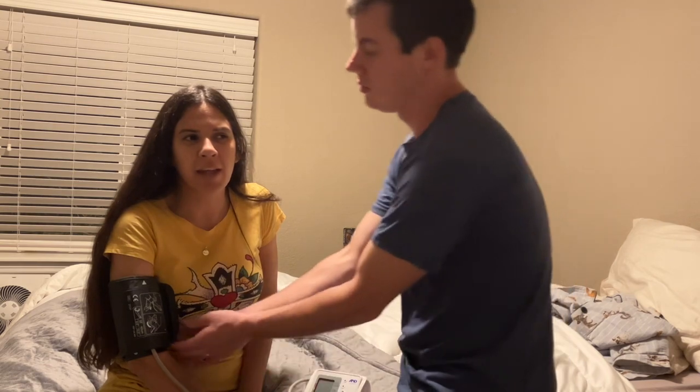It's kind of annoying, but it's okay. I can't talk or it won't be accurate. And my pulse is 84, which is good because it has been like 98 lately.